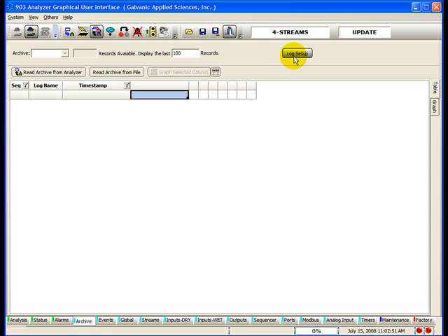The software will tell you when to wait as it processes any data and shows the progress status on the bottom bar. The 903 GUI is designed to stay in sync with the analyzer at all times. The analyzer itself always acts as a primary data holder. The 903 GUI automatically refreshes the tabs when opened with the data from the analyzer.